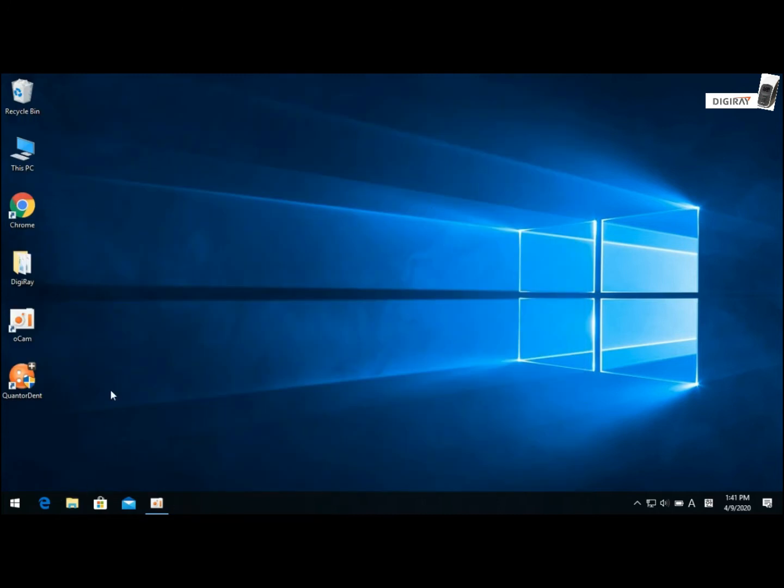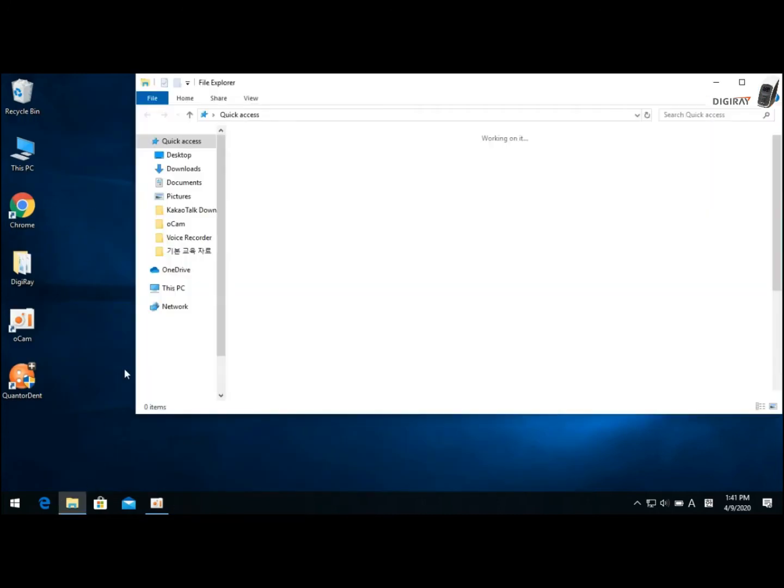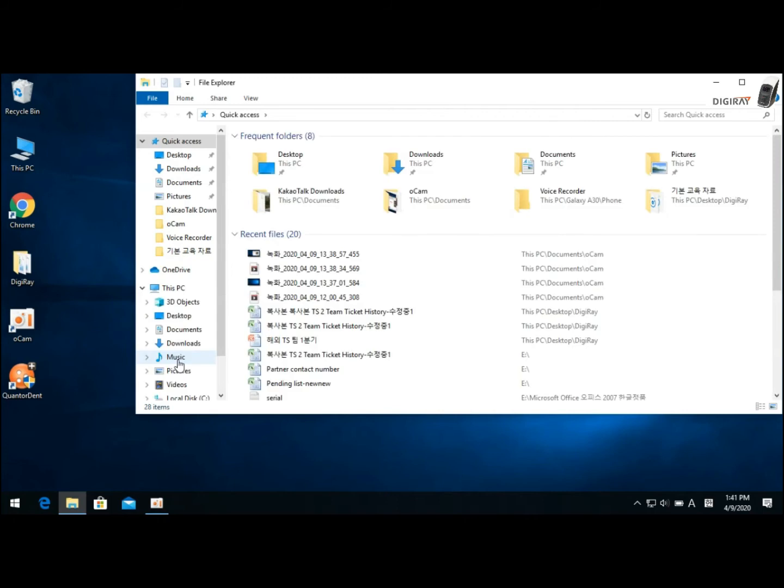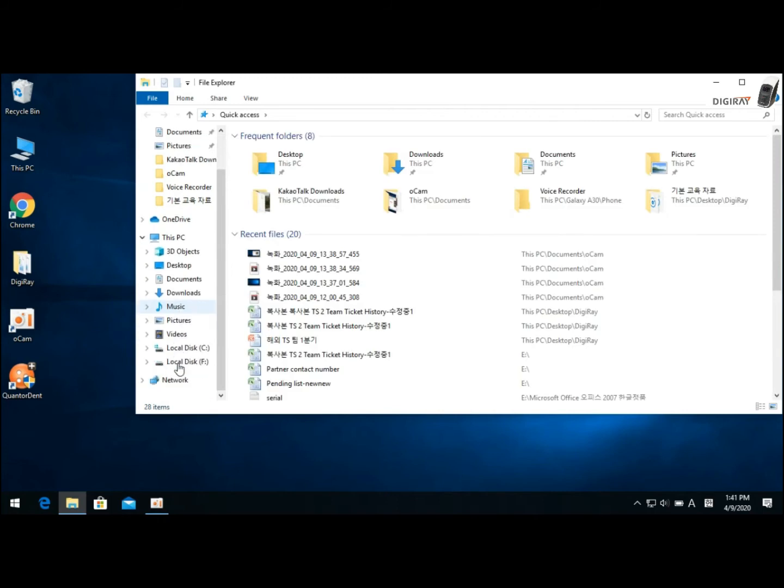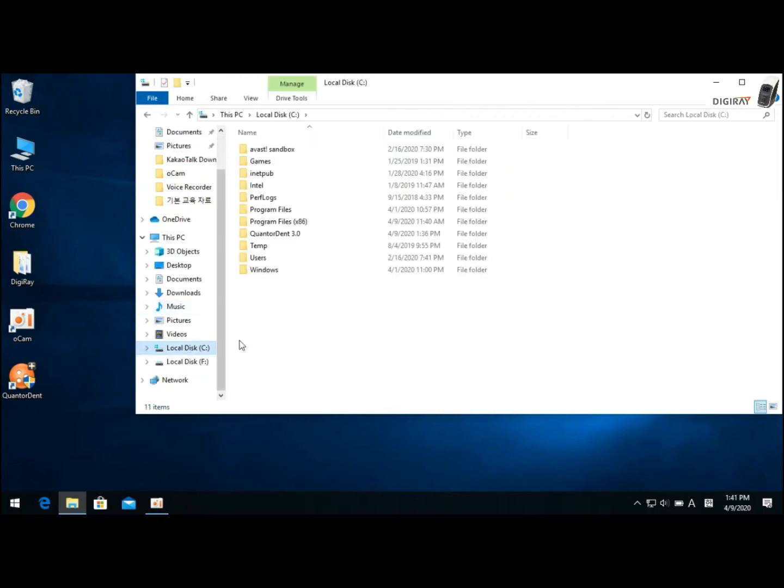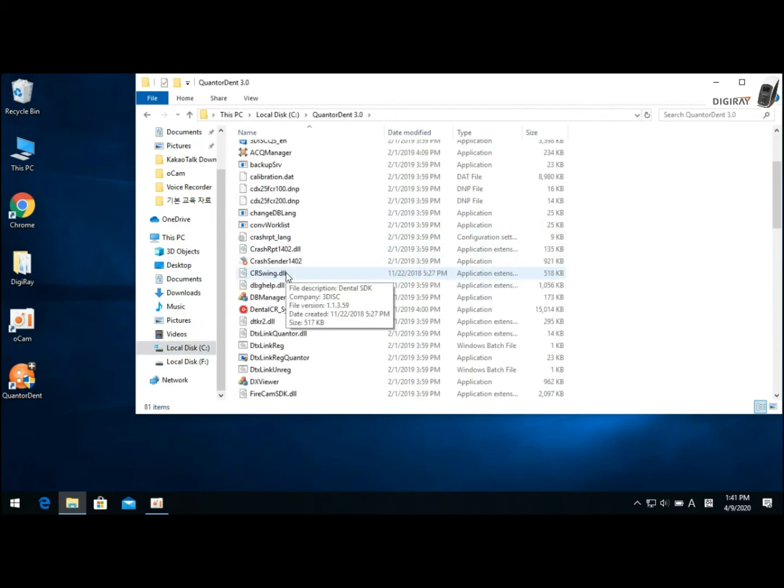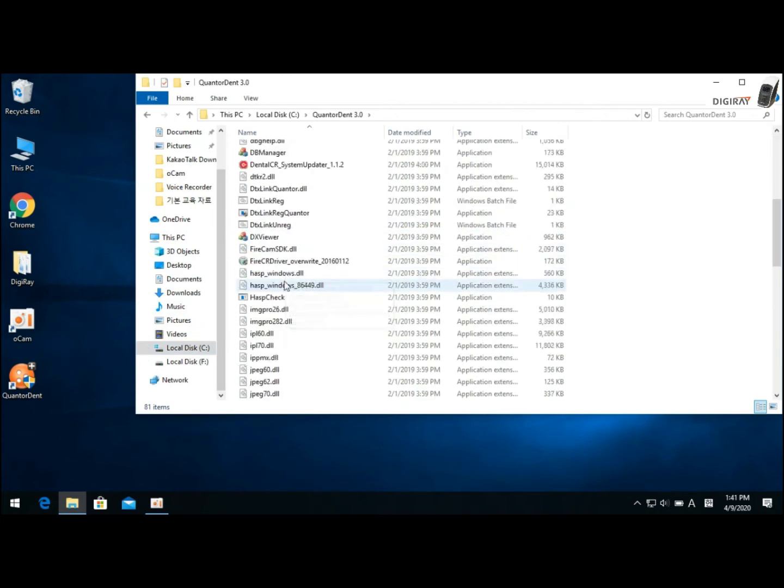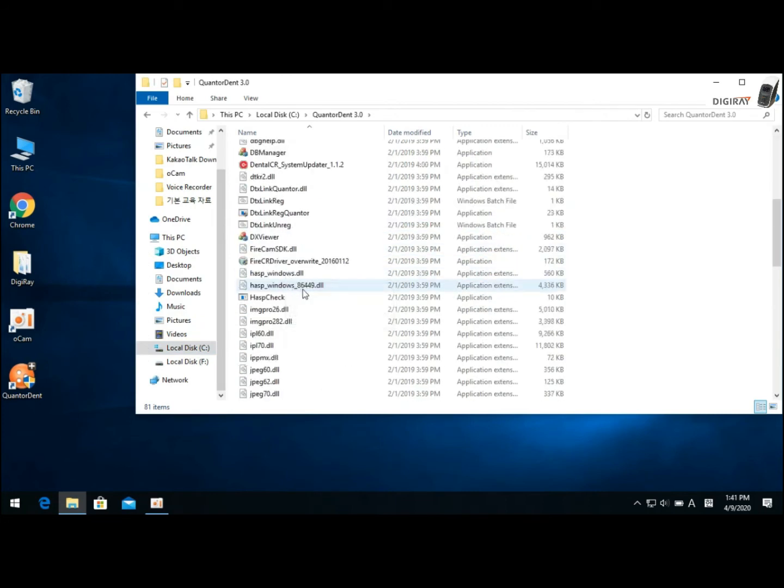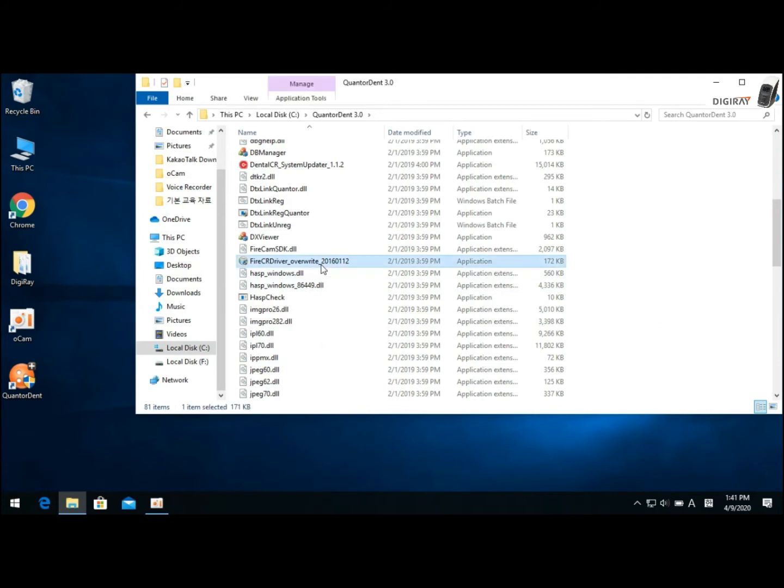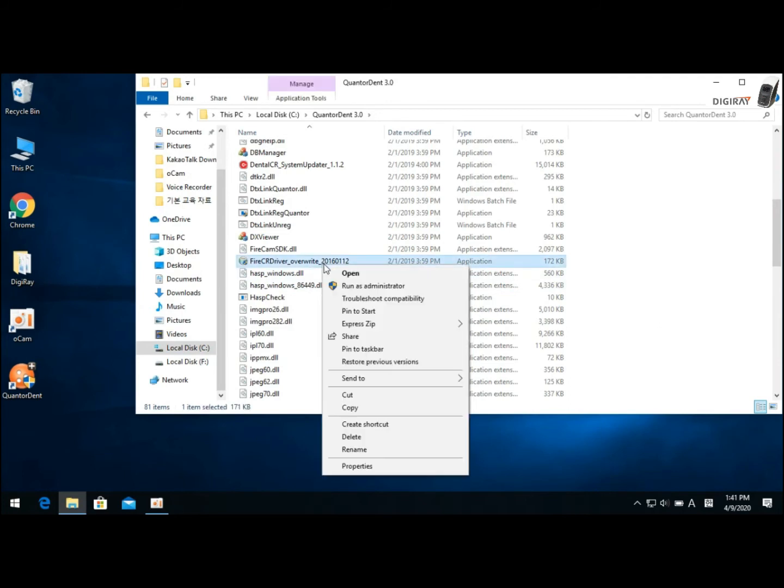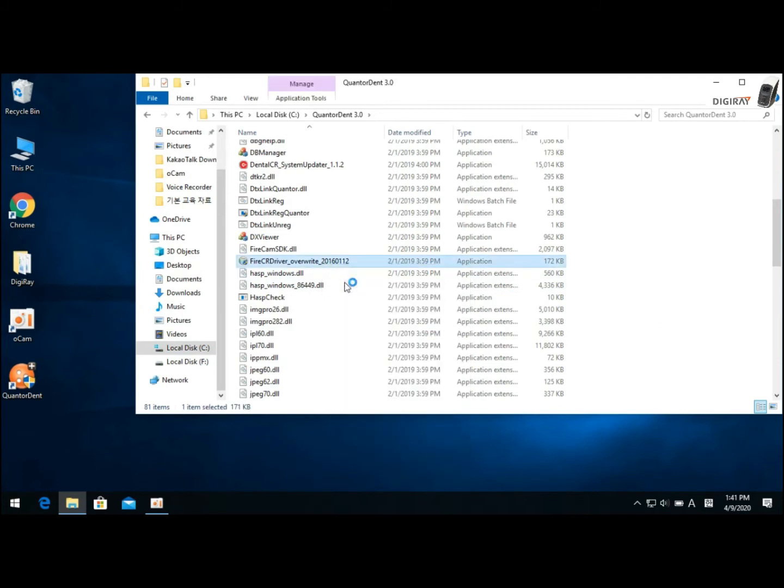Now, to fix this problem, you must run the FireCR driver underscore overwrite, which you can find from the QuantorDent folder. So scroll down and run FireCR driver overwrite as an administrator.